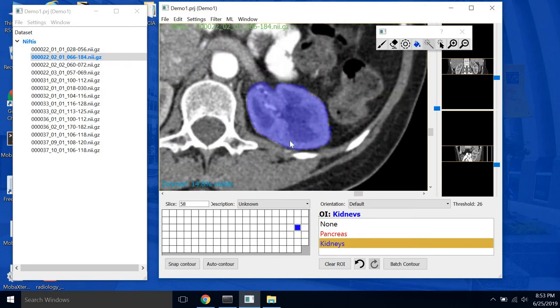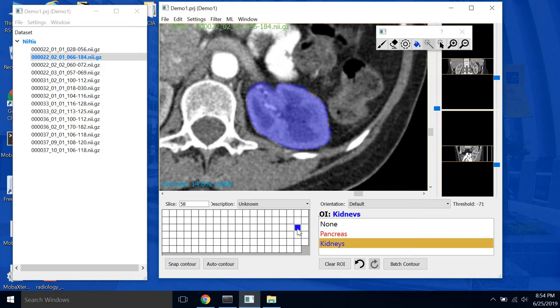So RealContour has this window down here which displays all of the slices. So each slice in our scan is one box. And you'll notice actually that the box that we have selected is filled in with blue. It'll actually fill in the color of the ROI for each slice that the ROI is present. So it lets you keep track of where in the scan you're located.